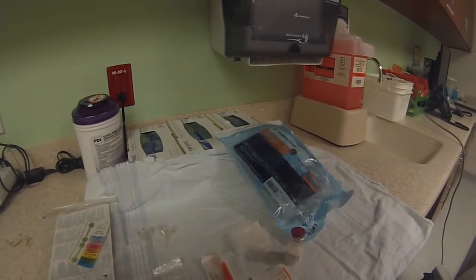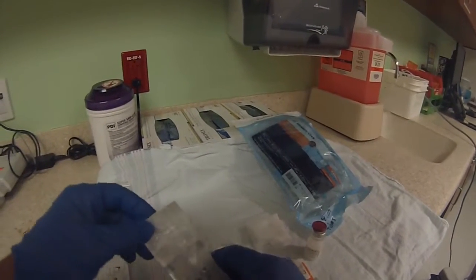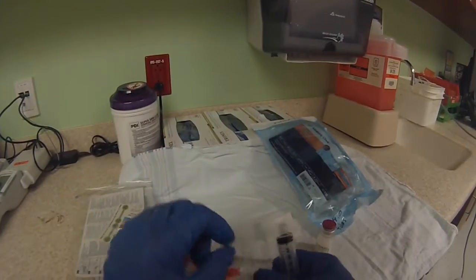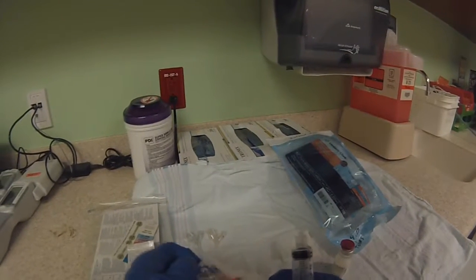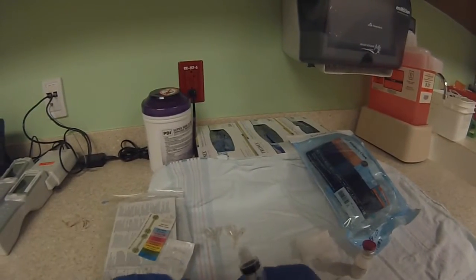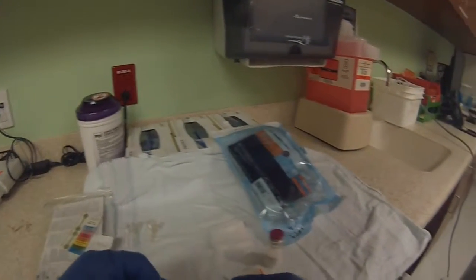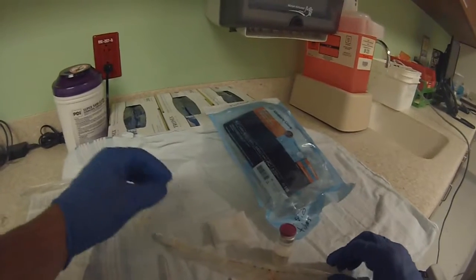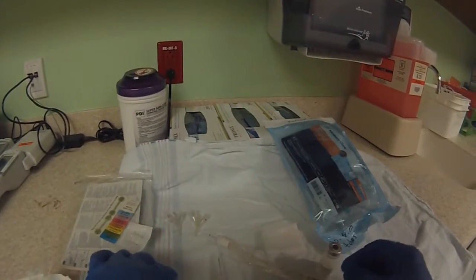The first thing you want to do is you want to prime the catheter. You need a 10 cc syringe, a needle — 18 gauge is what you use — and then you need the catheter. You've got your InfoSurf.